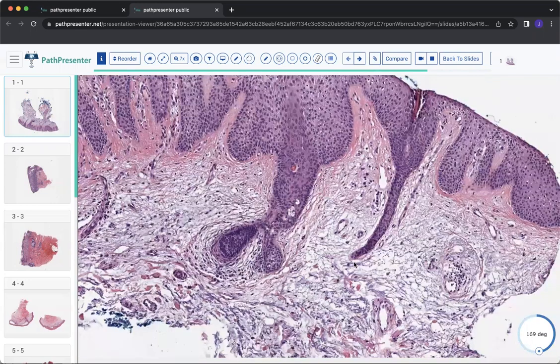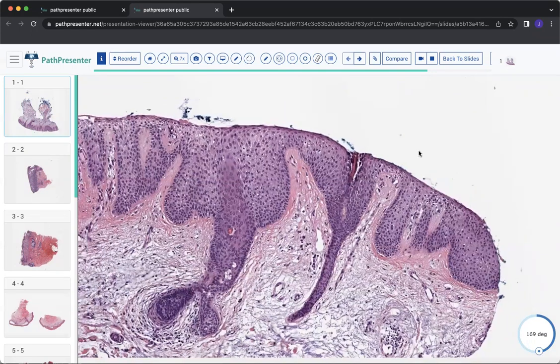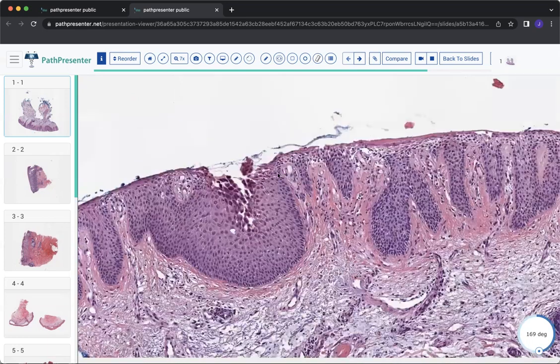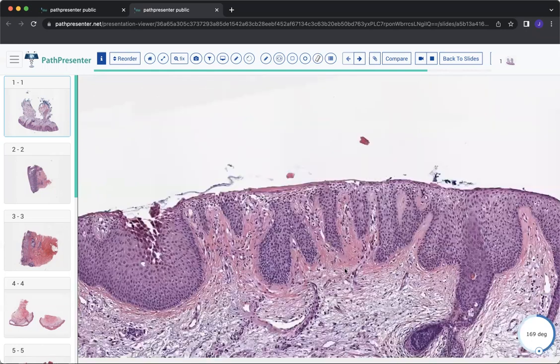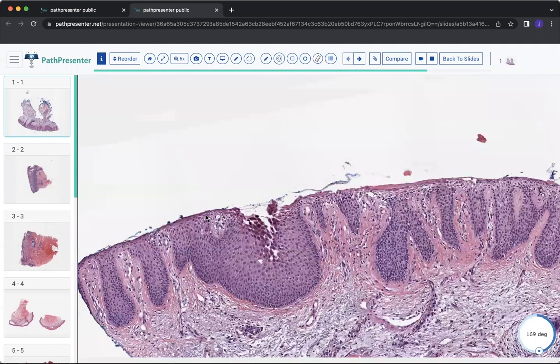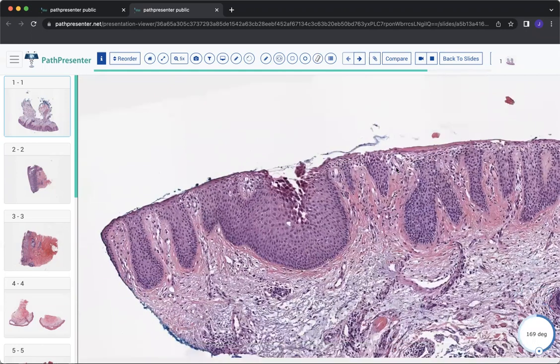Looking at the epidermis here, there seems to be a lack of granular layer and a lack of stratum corneum. You might be thinking, I've seen a lack of a granular layer before in psoriasis, for example. But usually with classic psoriasis, you'll not only find regular psoriasiform hyperplasia, but also parakeratosis with abundant neutrophils in the stratum corneum in untreated psoriasis.